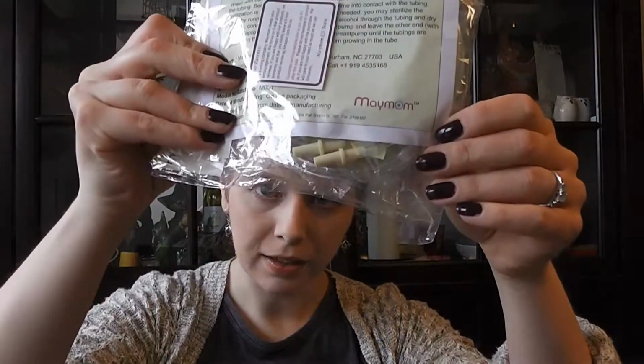And these were not expensive. I found some company selling basically the same tubing on Amazon, and I think it was like $8 for 4 tubes. So I've got my backup tubing in there if I need it. You can also carry backup little plastic discs, because they can sometimes break or tear. I've had one go through the garbage disposal. That wasn't too good.